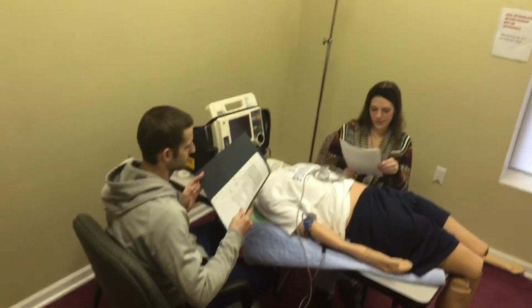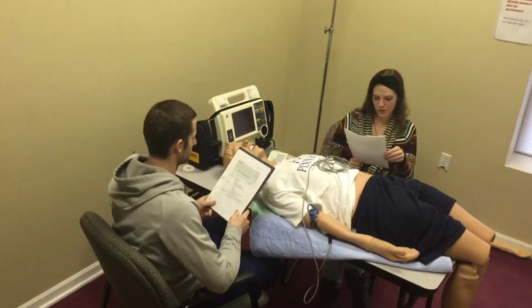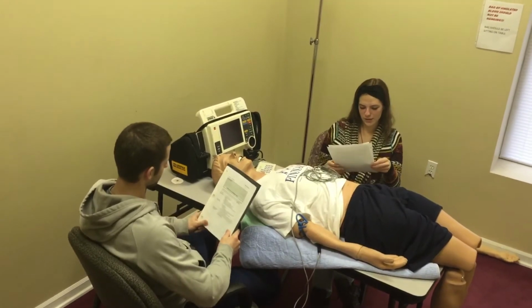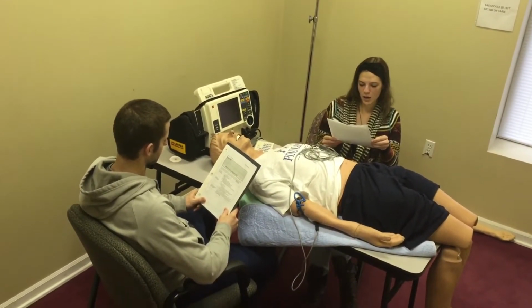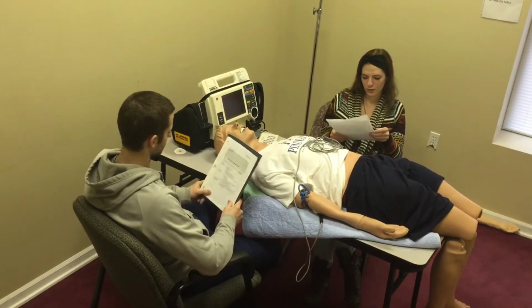Patient with the above rhythm is a 62-year-old woman who has generalized weakness, shortness of breath, and nausea. Her blood pressure is 86/50. Her pulse rate corresponds to the EKG rhythm, 50 and irregular. Respirations are 24 breaths per minute with normal tidal volume.